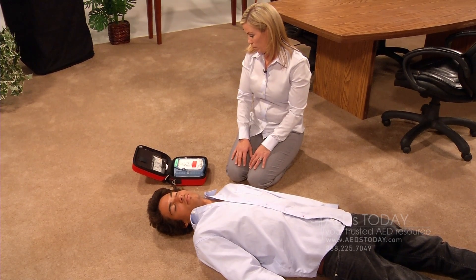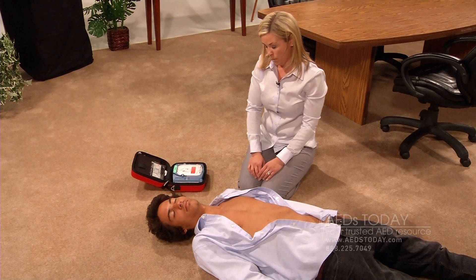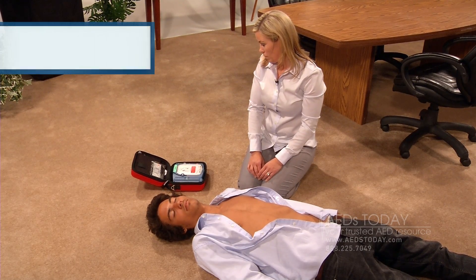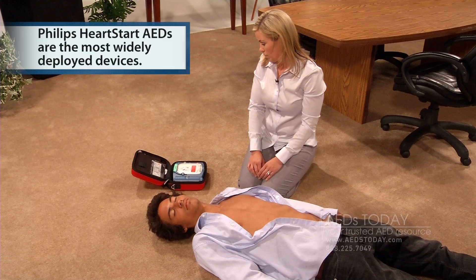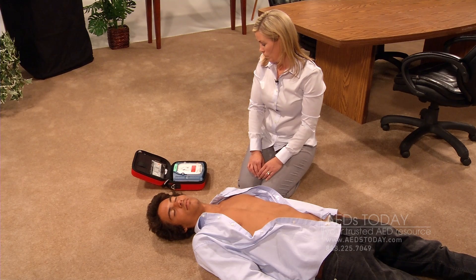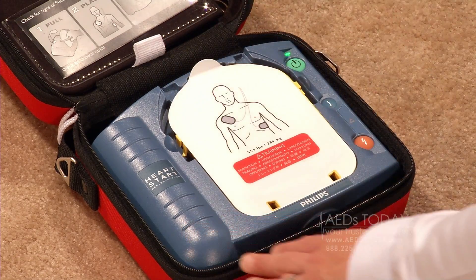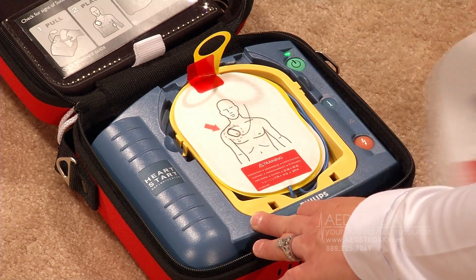Begin by removing all clothing from the patient's chest. Cut clothing if needed. You have already called 911, so remove the clothing from the patient's chest as quickly as possible. When the patient's chest is bare, remove the protective cover and take out the white adhesive pads. These are the electrode pads.